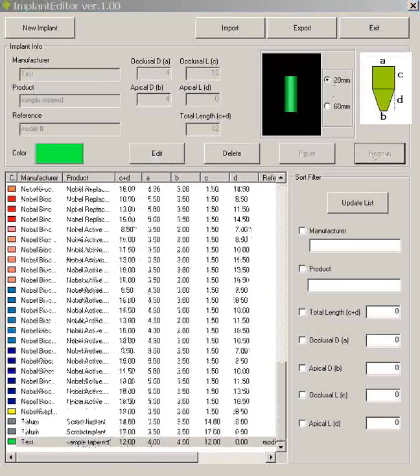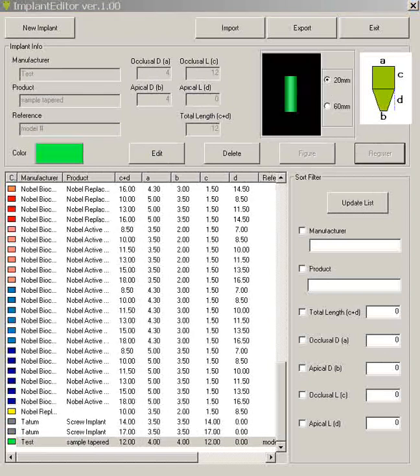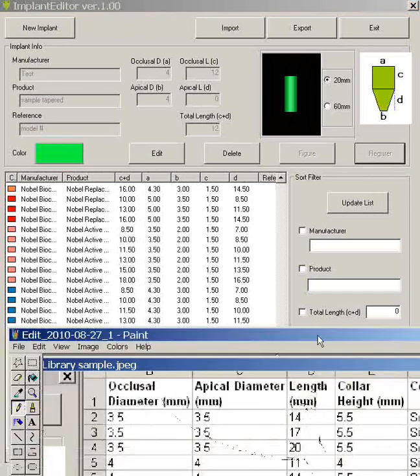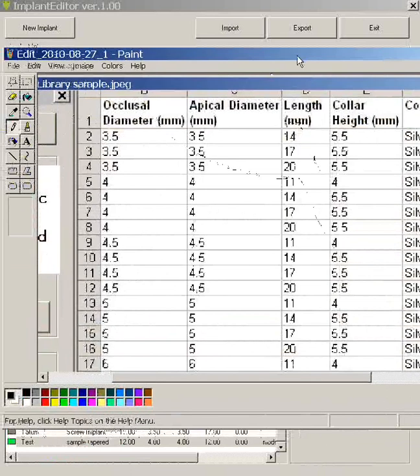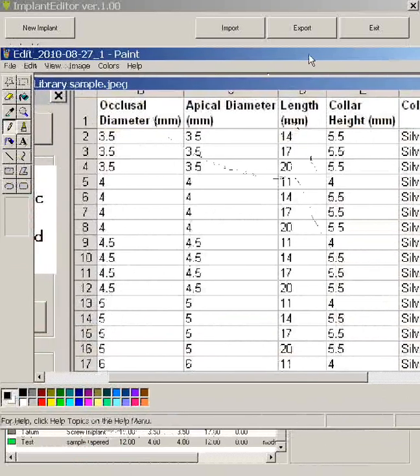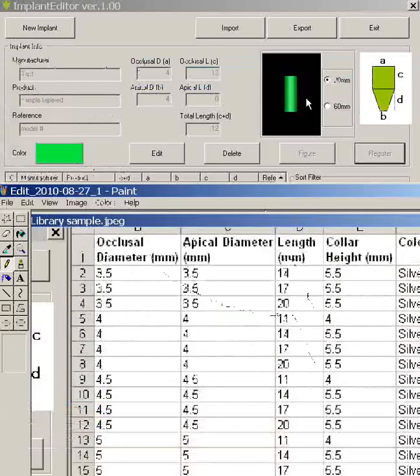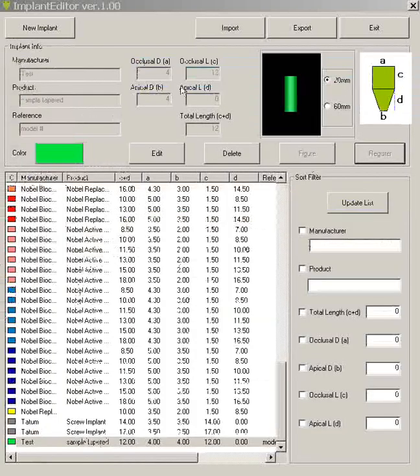So really it's a simple process to register your shapes. Just make sure from your specific implant manufacturers that you're getting the correct dimensions and that you're inputting the correct dimensions in this parameter. So that's very key.